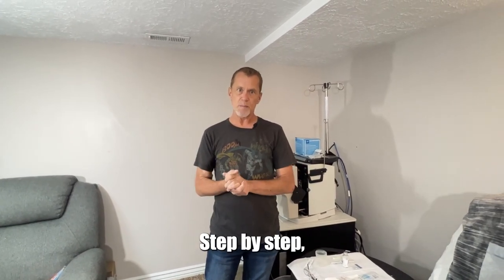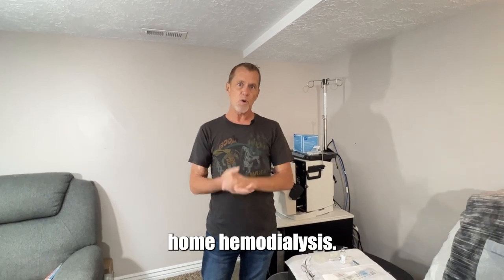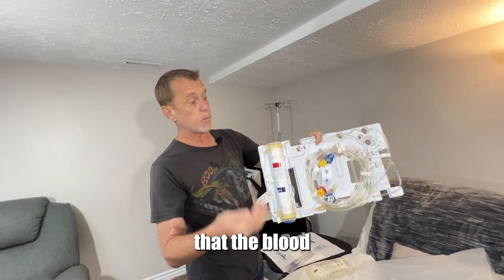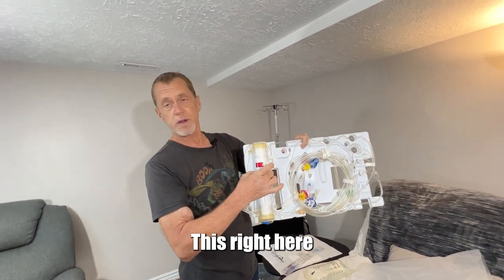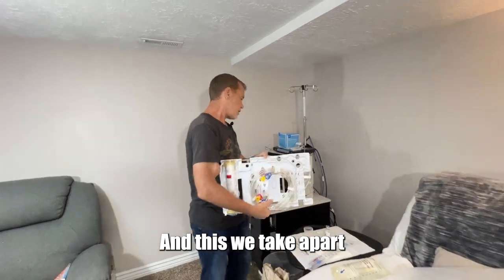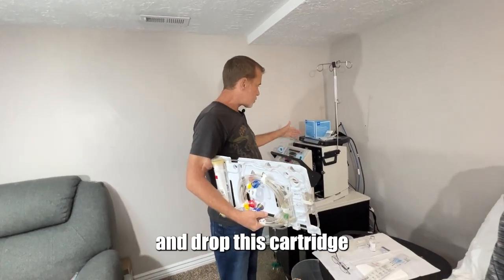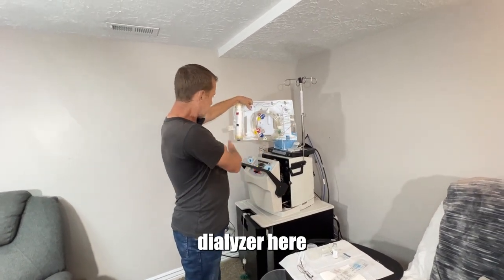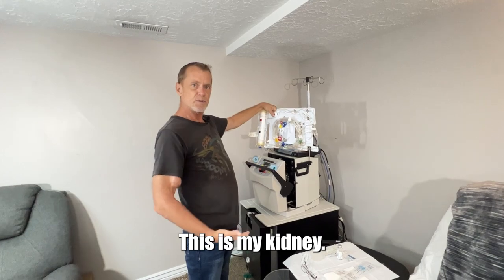So here we go — a step-by-step walkthrough to do home hemodialysis. This is the cartridge, the actual dialyzer that the blood pumps through. This right here is what actually filters out the toxins. This is all the tubing, and we take it apart and drop this cartridge right into the kidney machine. Right here, between the dialyzer and the machine — this is my kidney.